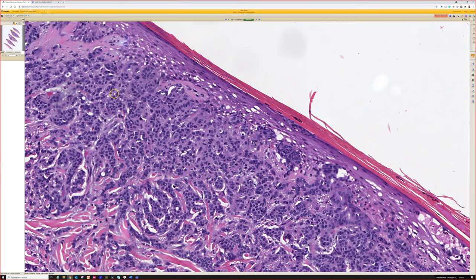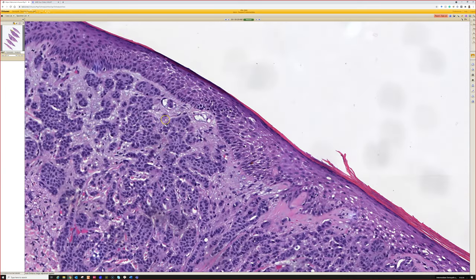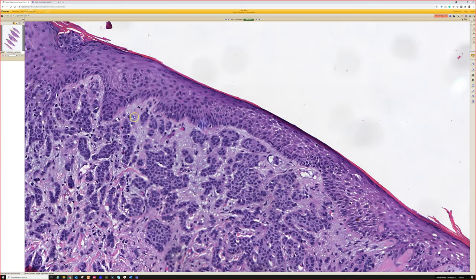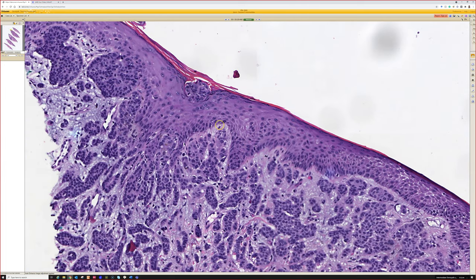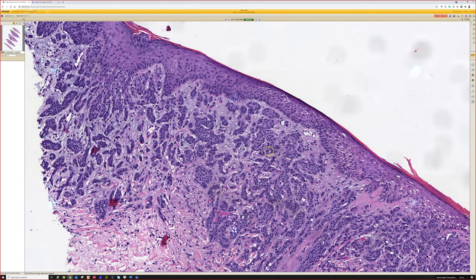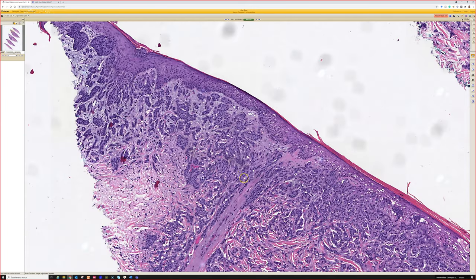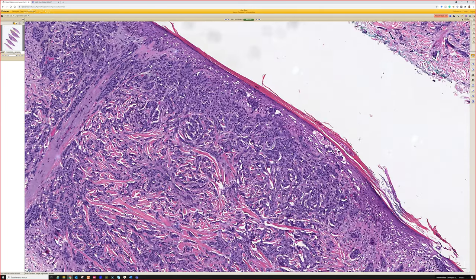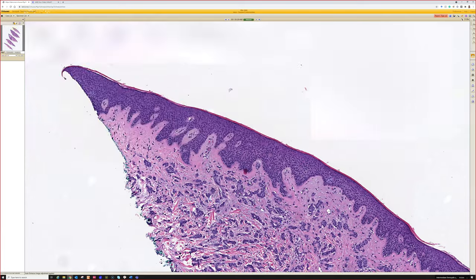You can also see that in other tumors, including metastatic carcinomas. I've seen a variety of different metastatic carcinomas have epidermotropism and grow into the overlying epidermis. So it's important to recognize that that can happen so that you don't mistake this for a primary just because it has epidermal involvement. I even saw an epithelioid sarcoma once that had a skin metastasis with epidermotropism. That was the wildest thing ever. That was a crazy case. Thankfully, we knew the history. I don't know how I would have recognized it otherwise.